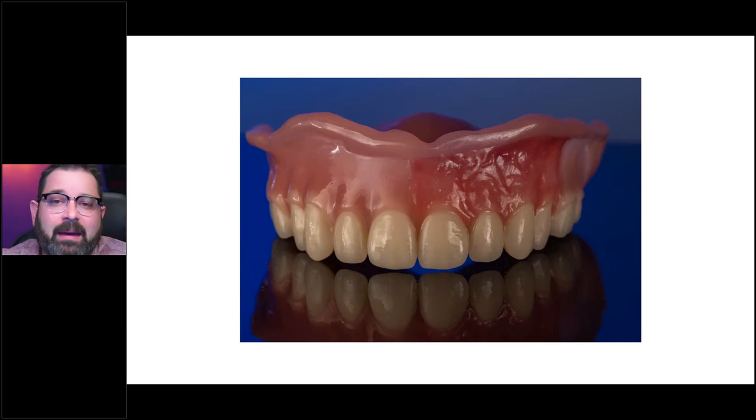In my opinion, aesthetics is not an issue. I can take a digital restoration and make it look good with composite. I've been doing that for years with regular restorations — pressing them back and doing it the analog way. We've been cutting them back and adding composite to them. With this case, it's actually only easier because the base is already printed and I don't have to press back.